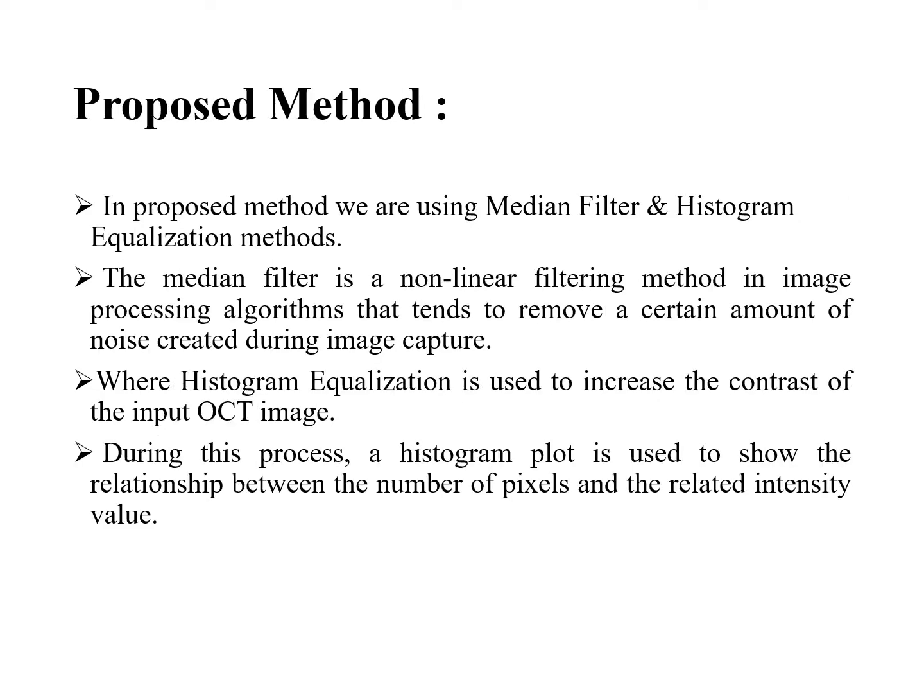Coming to proposed methods, we are using median filter and histogram equalization methods. The median filter is a nonlinear filtering method. It is used to remove the noise during capturing of the input image, whereas histogram equalization is used to increase the contrast of the input OCT image.